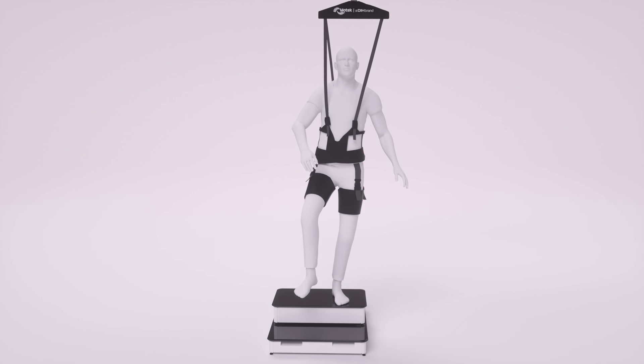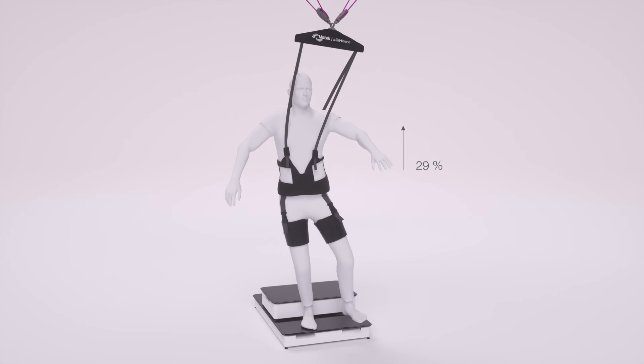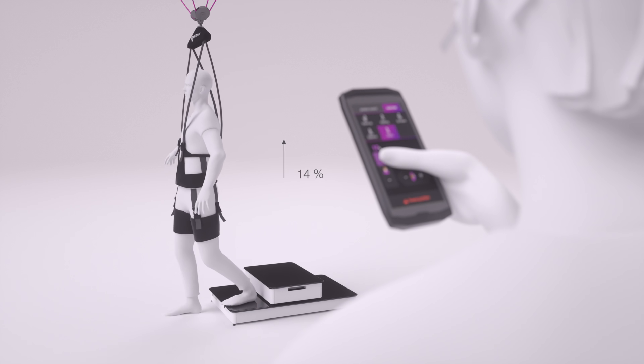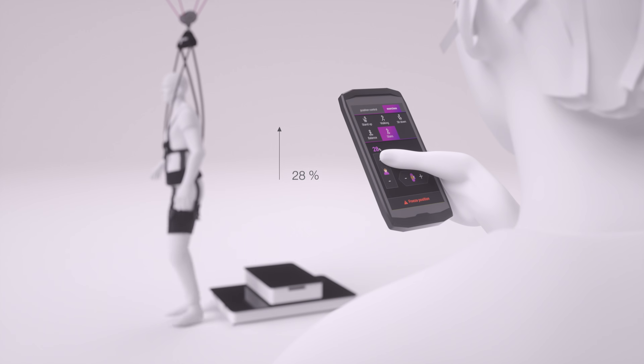Meanwhile, therapists can apply assistive forces as needed, both close to the patient or from a distance, always in full control via the mobile app.